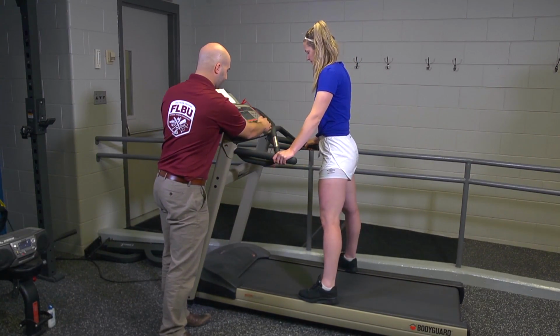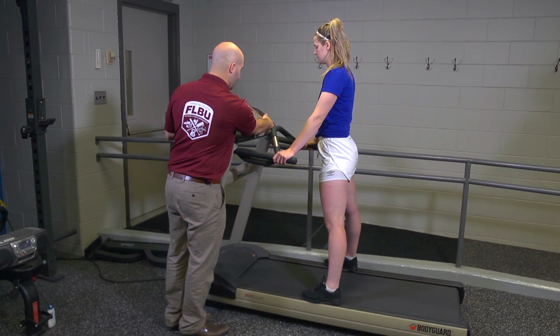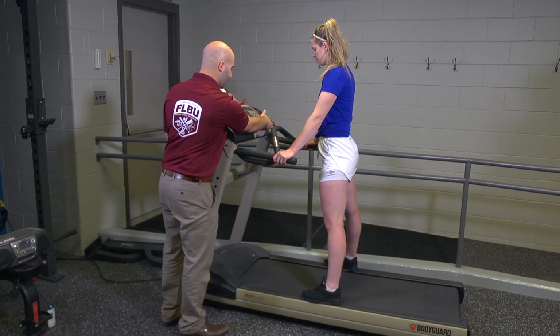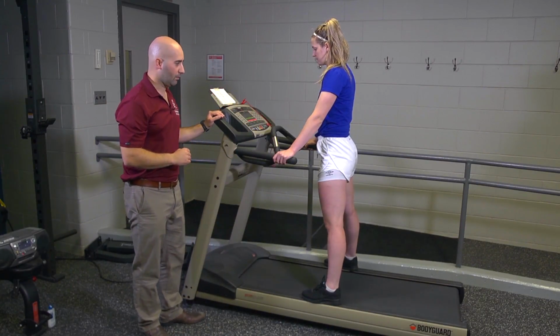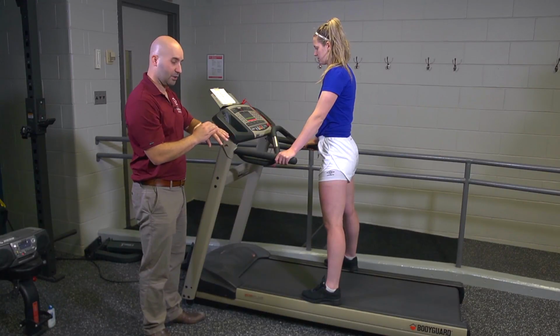I'll start increasing the speed to 3.8 miles an hour. That's the speed I've selected for her, with 0 elevation for this warm-up load. Now, I haven't started my time yet. I would start it once she actually steps on.